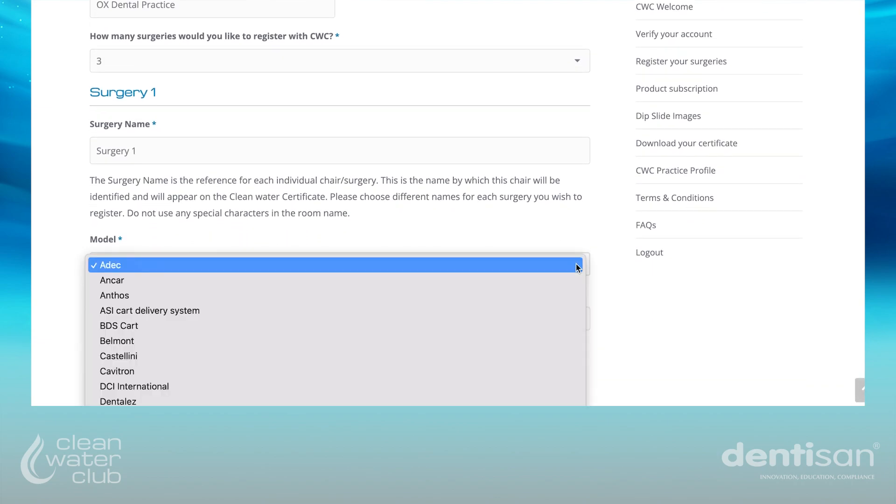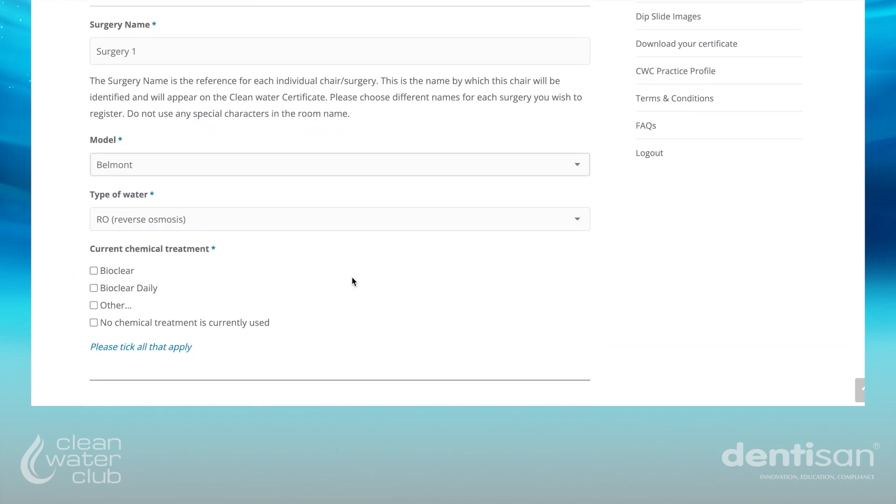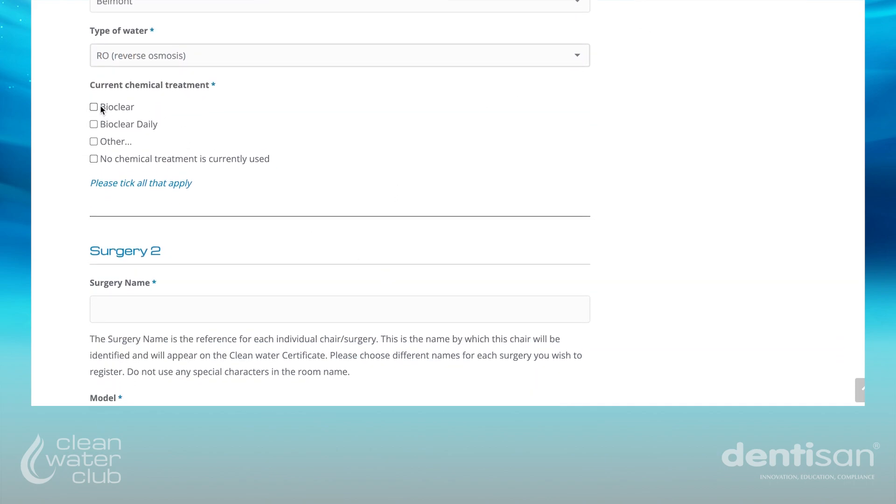Select the model of treatment centre from the drop down menu and the type of water used in the chair. Finally, select the current chemical treatment being used for the chair.